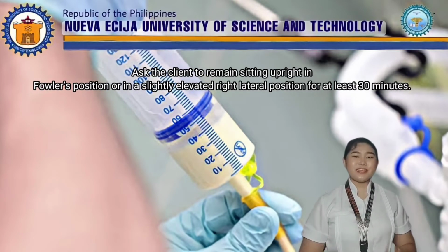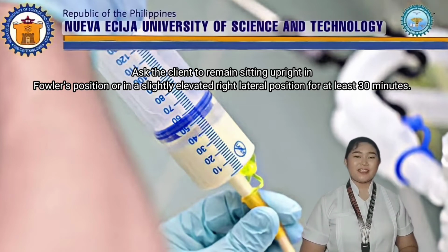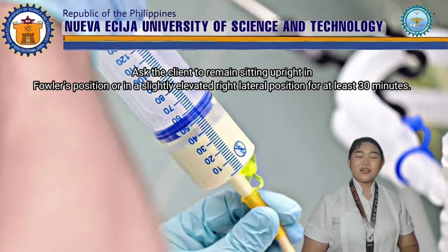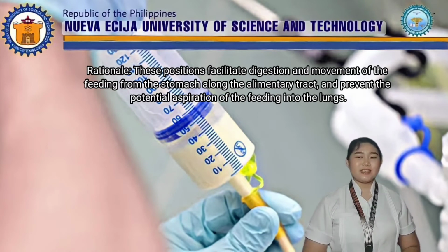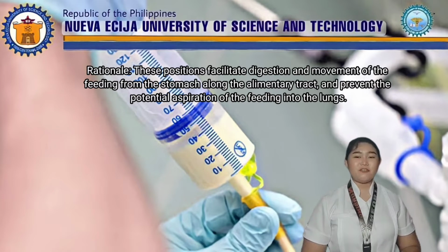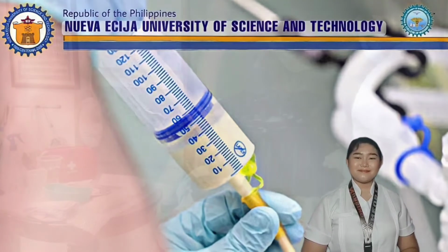Ask the client to remain sitting upright in Fowler's position or in a slightly elevated right lateral position for at least 30 minutes. Rationale, these positions facilitate digestion and movement of the feeding from the stomach along the alimentary tract and prevent the potential aspiration of the feeding into the lungs.